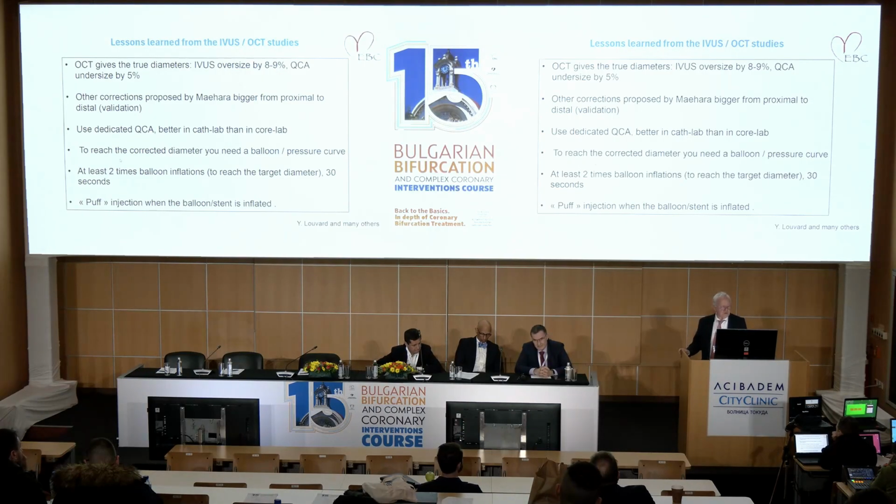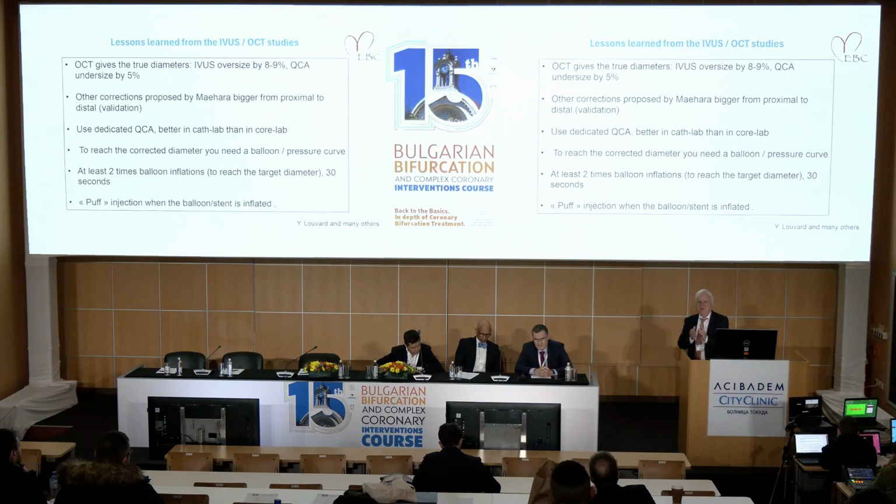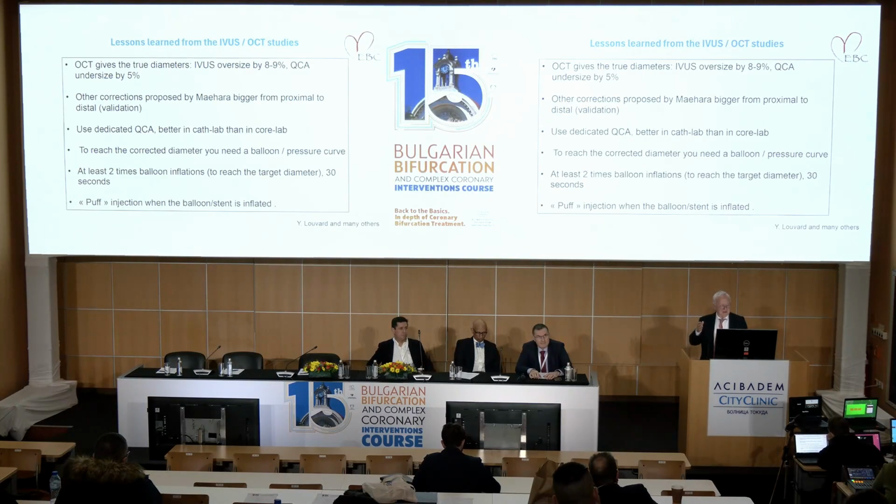You have to inflate at least 2 times, because the balloon is not completely unfolded at the first inflation. And a second point, also from a French study: the time is also a factor, and we discovered that the balloon is not only elastic, which is its function, but also plastic. The balloon increases in diameter with the number of inflations. You will find that in a good Polish paper, Skowronski.